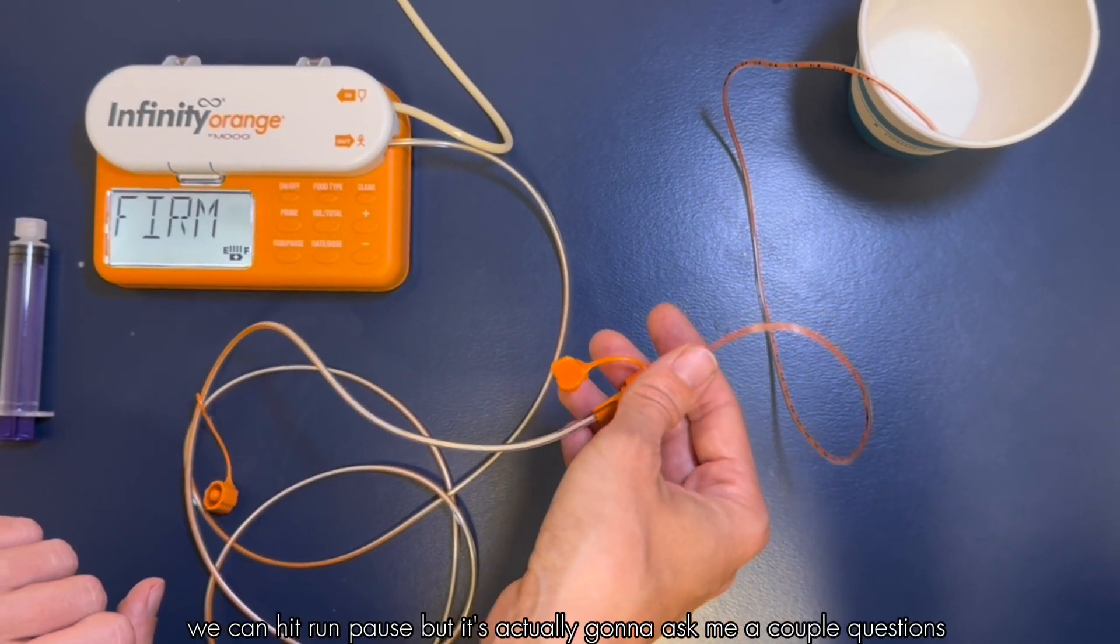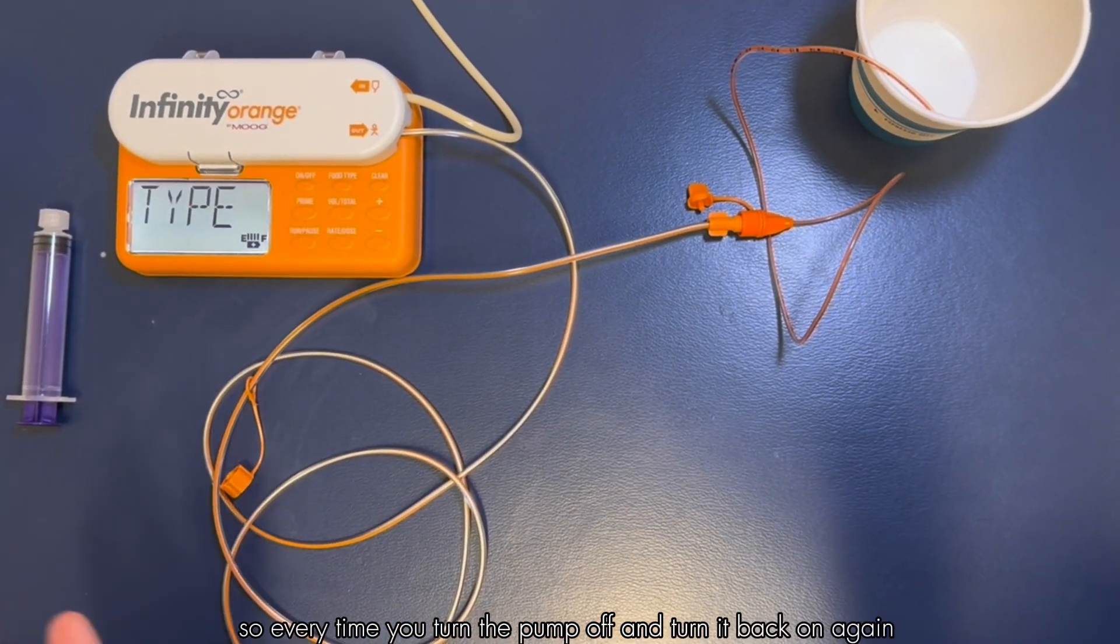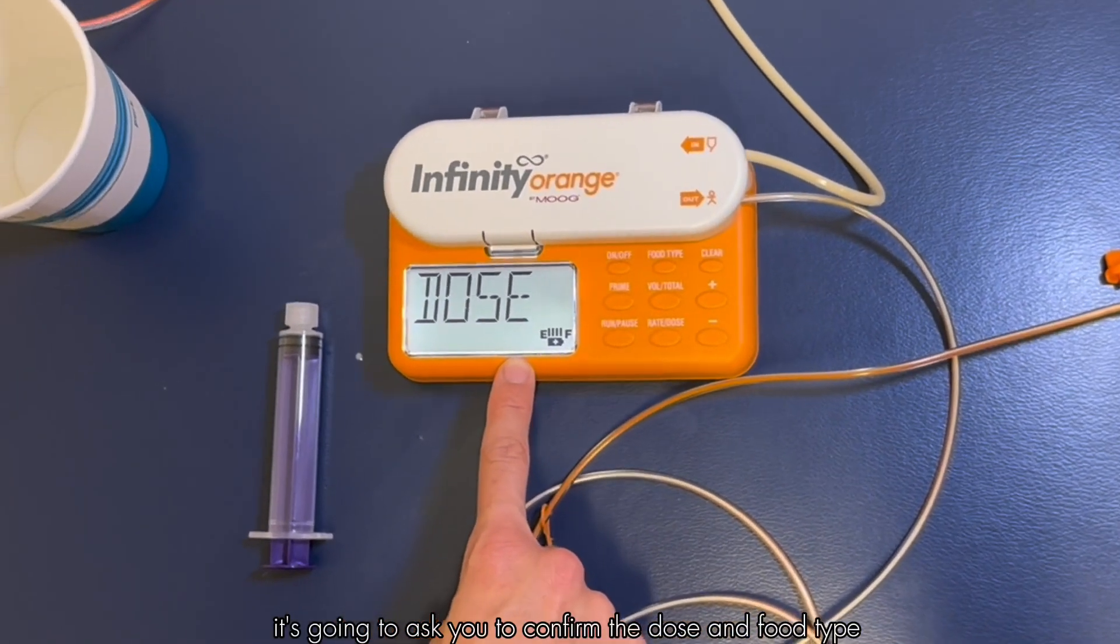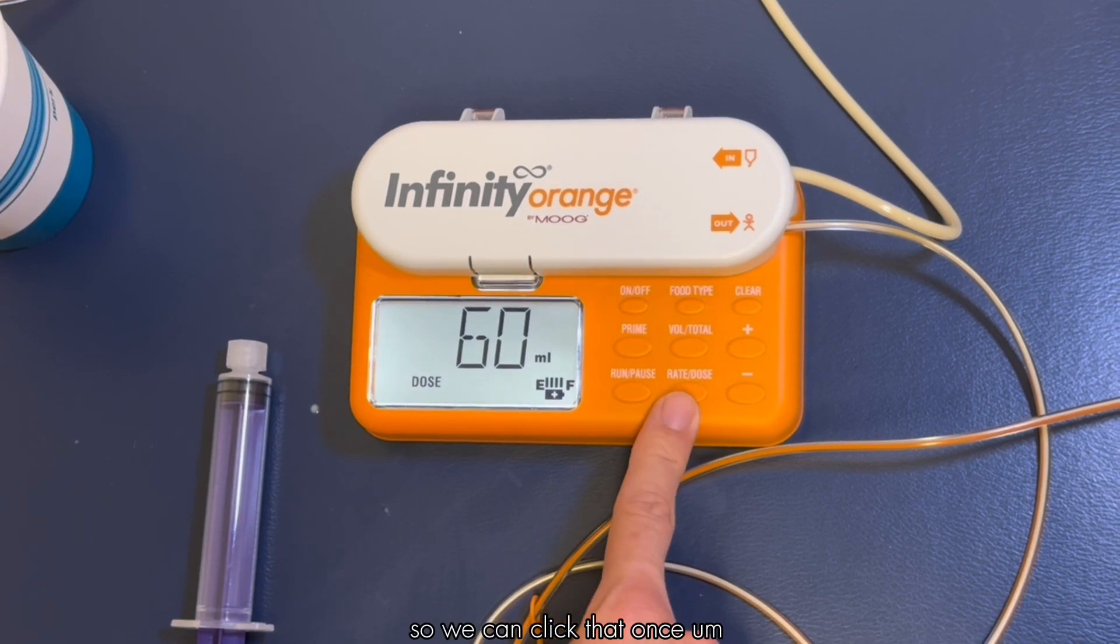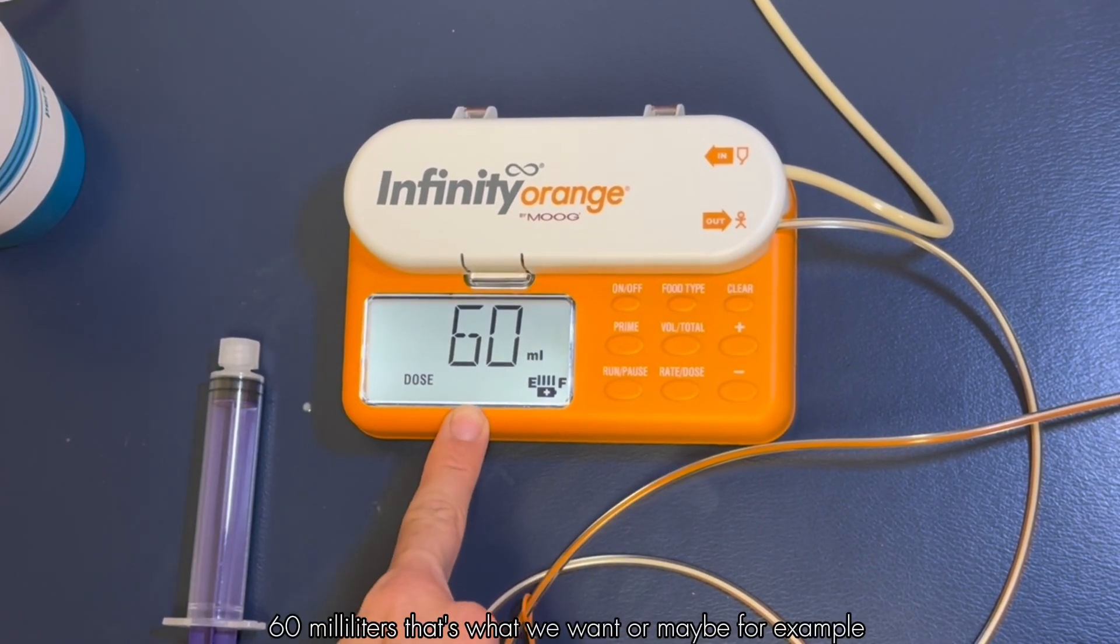But it's actually going to ask me a couple questions. Every time you turn the pump off and turn it back on again and go to start the tube feeding, it's going to ask you to confirm the dose and food type. Our dose button is here with our rate dose. We can click that once and then that'll show us the dose 60 milliliters. That's what we want.